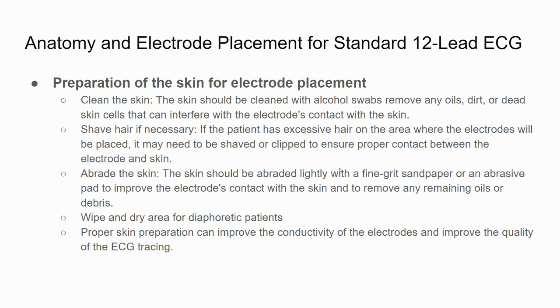For our patients who are extremely diaphoretic, which again can be very common in a patient who's having a myocardial infarction, you will have to wipe and dry the area to make sure that the electrodes stick. Some of our newer electrodes now have a little gel underneath, which is very practical for patients who are extremely diaphoretic. Before, we only had the adhesive pad, which didn't really stick well to patients who are diaphoretic. So if you ever feel that little jelly underneath it, obviously it helps with the conduction, but it also helps keep that electrode on the patient's skin.